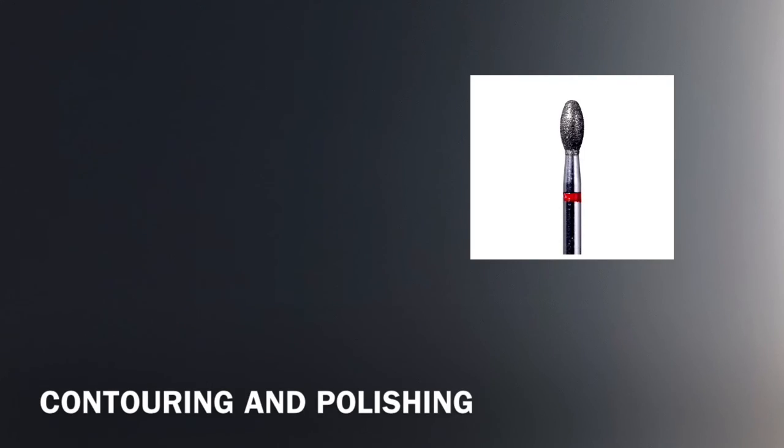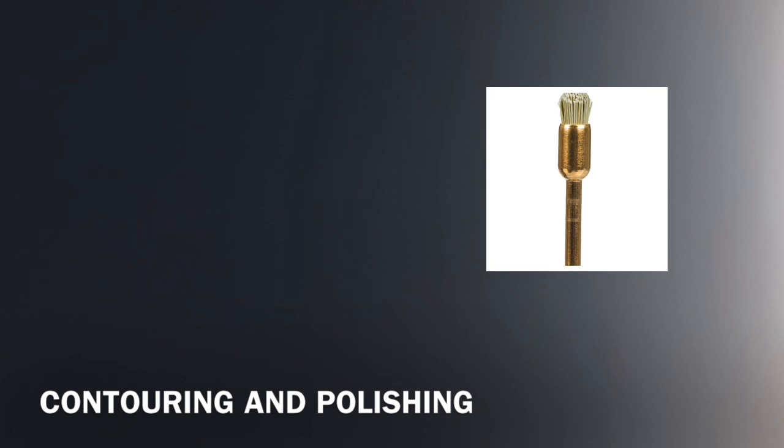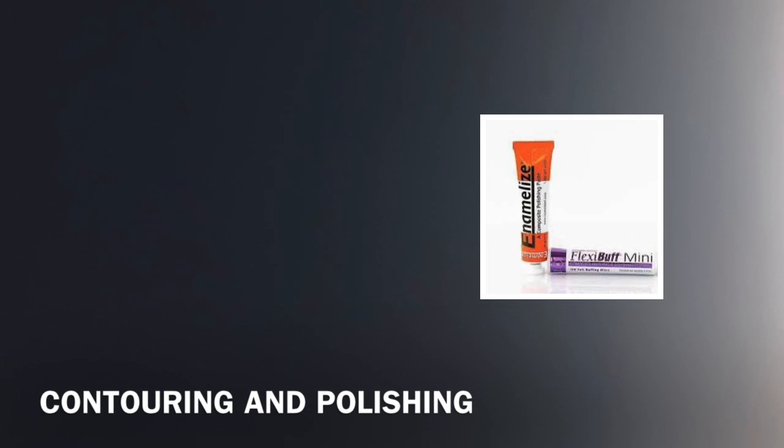To contour your restoration, you can utilize the football burr sequence. To polish, you can use Shofu 1 gloss tips, followed by the Jiffy brush. And at the end, you can utilize an aluminum oxide polishing paste, such as Enamelize, on either a Profi tip or on gauze.